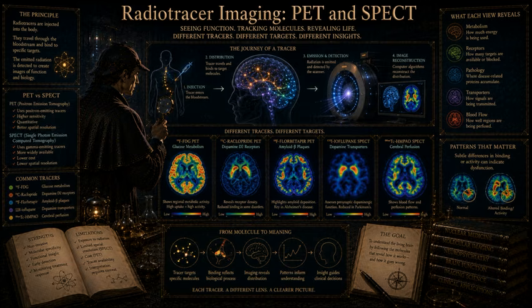So what happens to the tracer cars when they enter the cerebellum? Every single car that drives into the cerebellum has no choice but to either wander aimlessly or park on the grass. Therefore, in the cerebellum, there is no CS. CS equals 0. This means that in the cerebellum, the total signal the scanner sees, CT, is exactly equal to the non-displaceable background noise, CND.